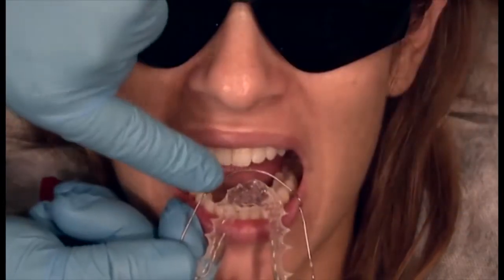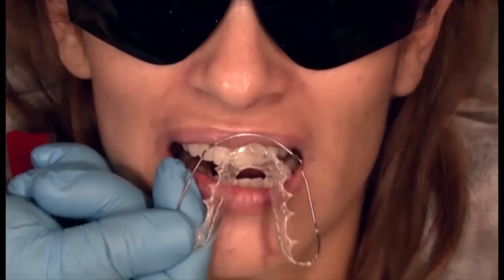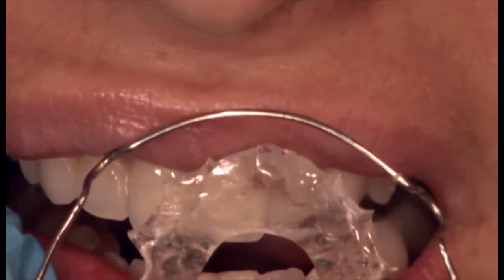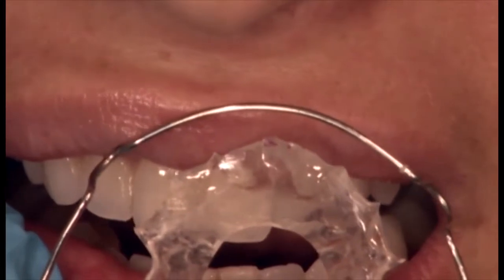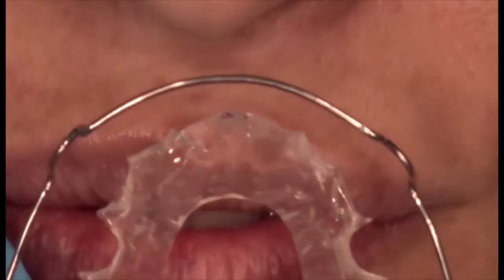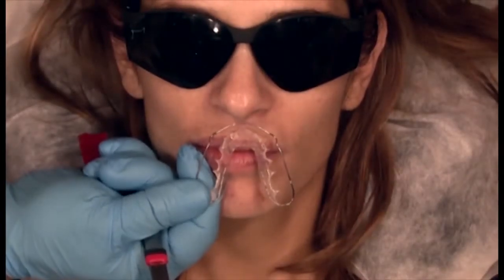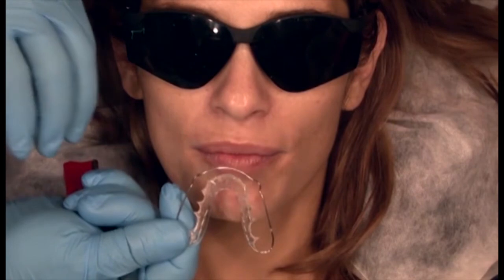At this point, the contact off the deprogrammer is very close to the edge, which means she's almost all the way closed down and she's coming close to the back of the front teeth. That's a really dangerous time because I get worried about constricting the envelope. I don't want the patient to be hitting into the front teeth until all the back teeth that I want in occlusion have already been accomplished.